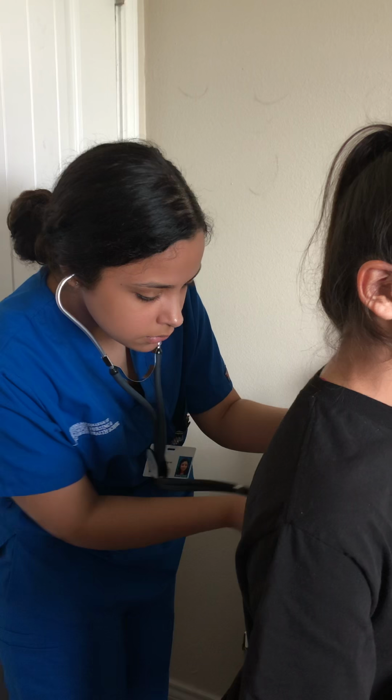Now I'm just going to need you, every time I press my stethoscope on you, to say 99. This is so I can make sure of the type of sounds I can hear from the patient, and whether there is any dullness or any abnormal sound as well. Okay, can you go ahead and say 99?